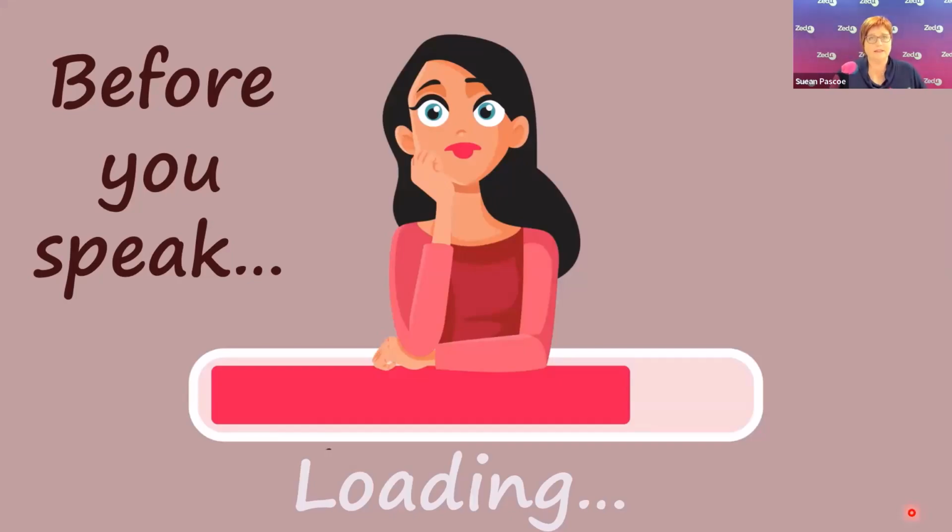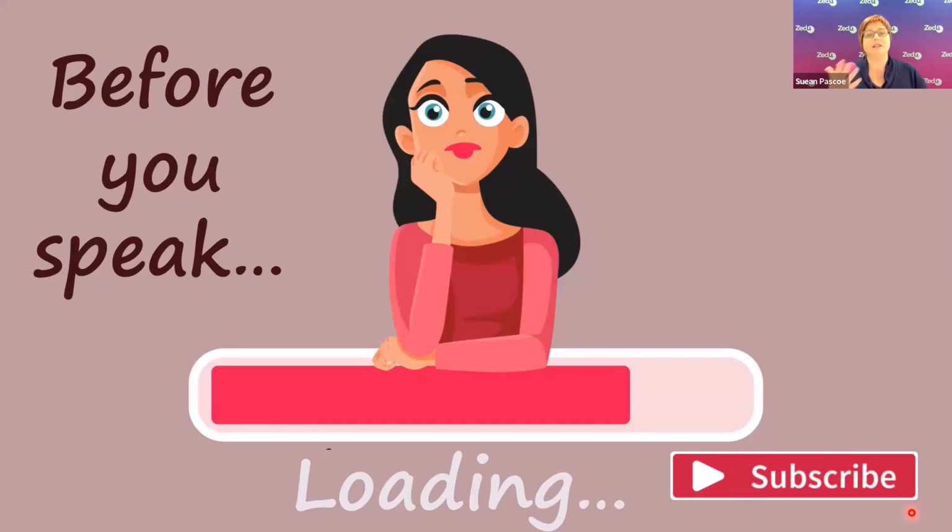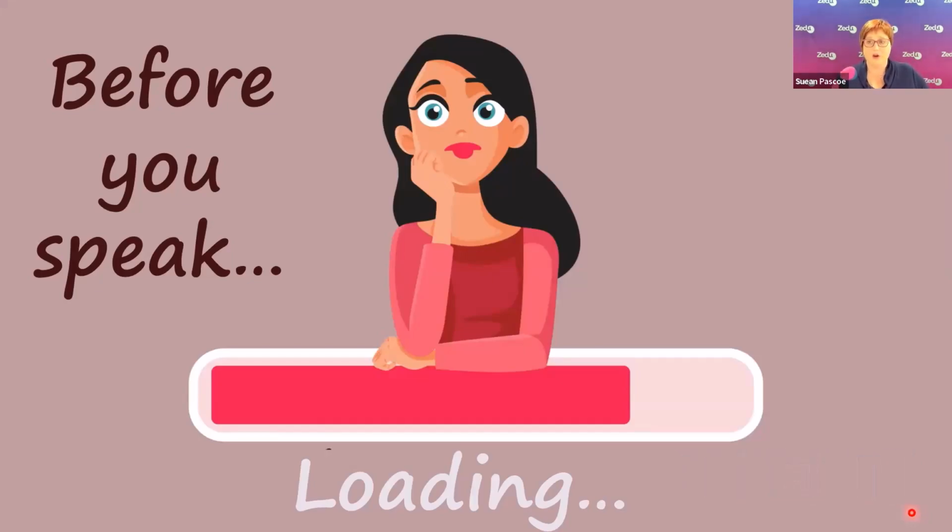So before you start talking, just take a moment, make sure you do a thorough scan going from lateral border to lateral border, inferior to superior, and make sure you start to think about, well, what are we going to say? I also say to my patients, to buy myself time, I'm going to just have a look at your anatomy first before we look at bub. I'm trying to just buy a little bit of time without the pressure of that anxious patient wanting an answer.